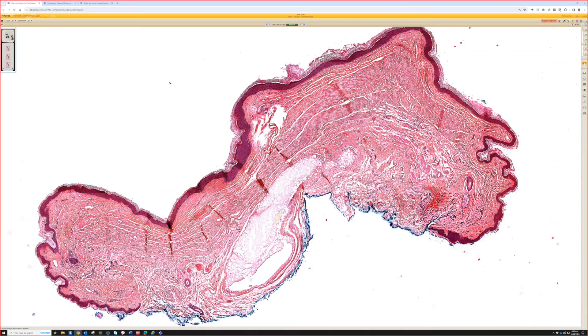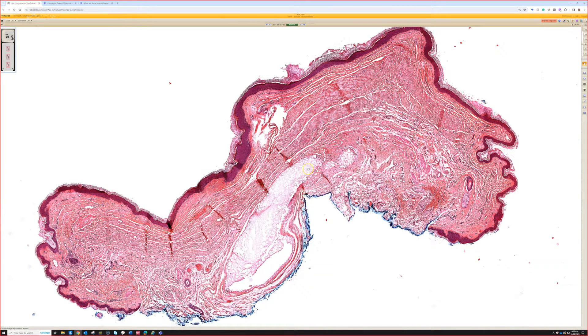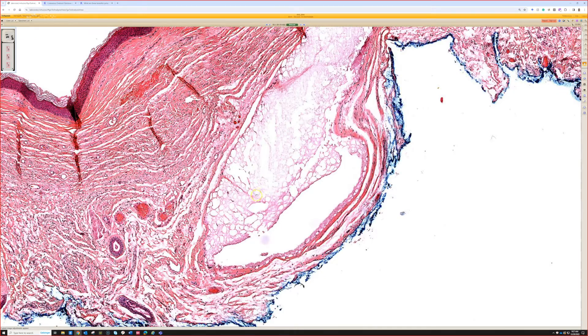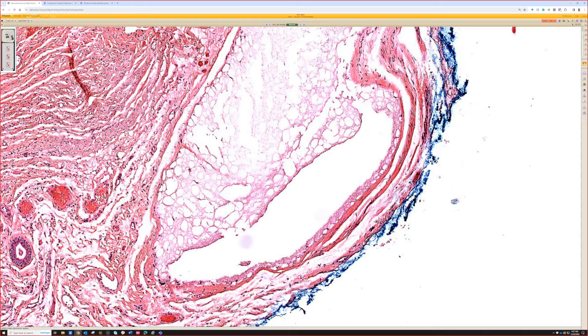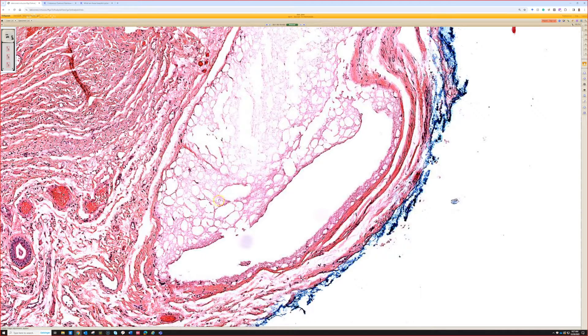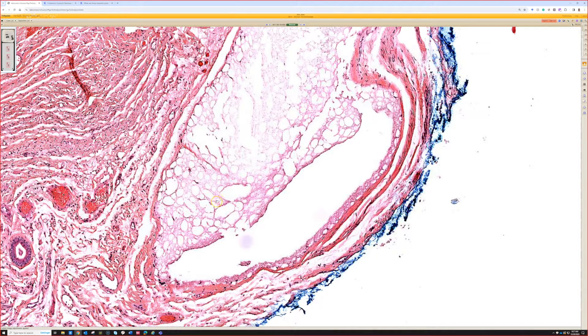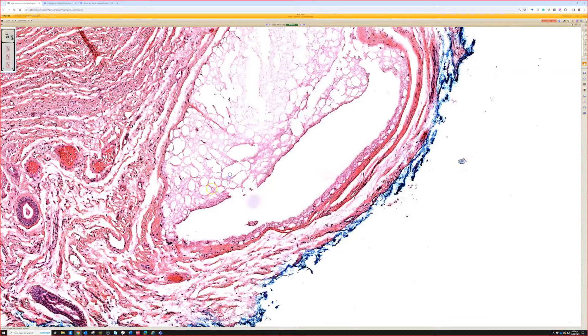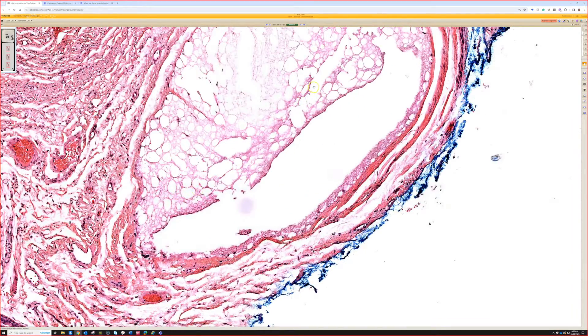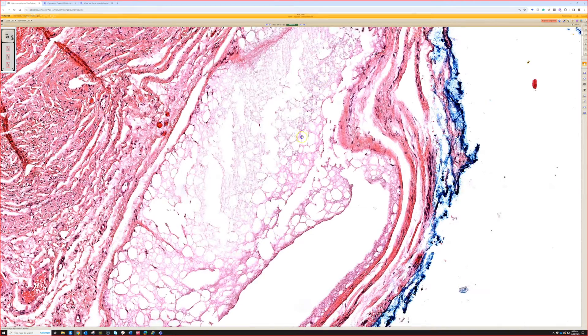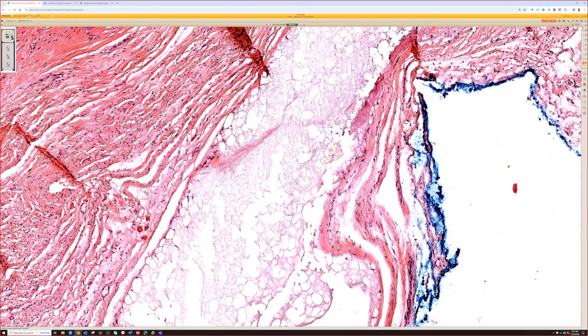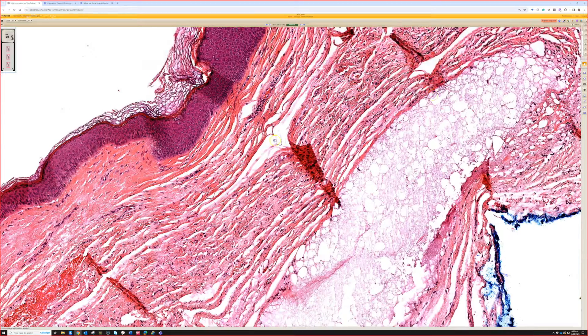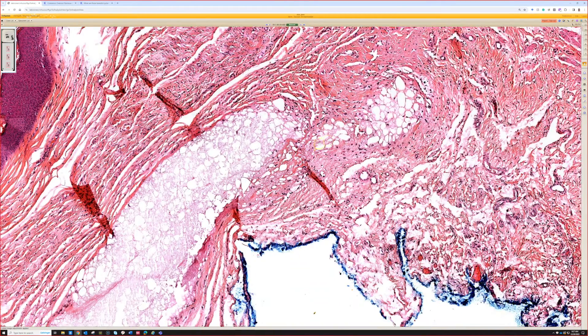So this is, at low power, we see a bubbly or mucoid-like nodule in the middle of this biopsy. It does not have the bluish tinge of mucus at this power, but we can stain it to prove it. It's in the background of a scar with this bubbly appearance.